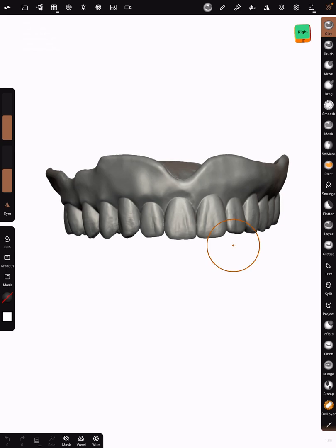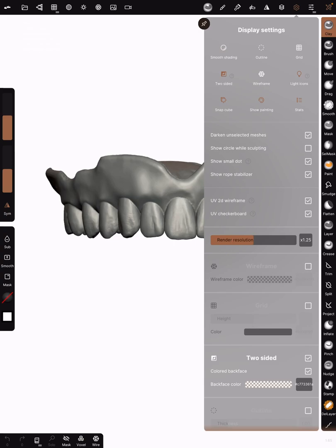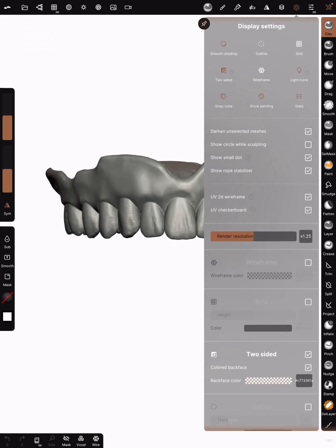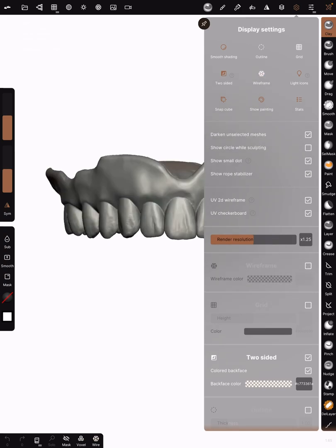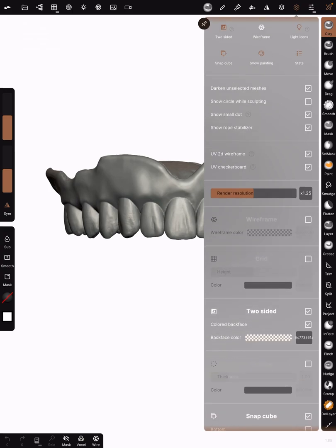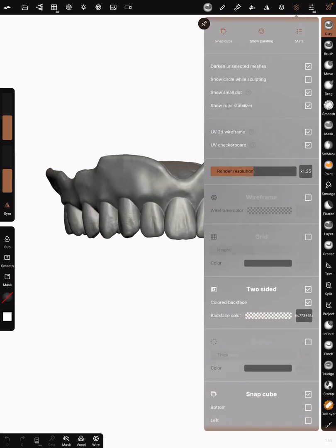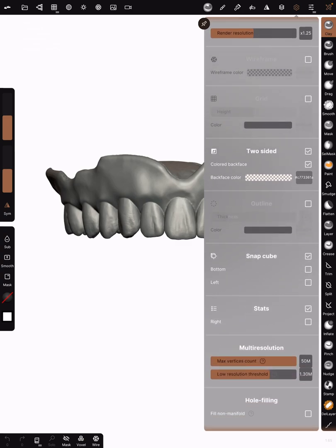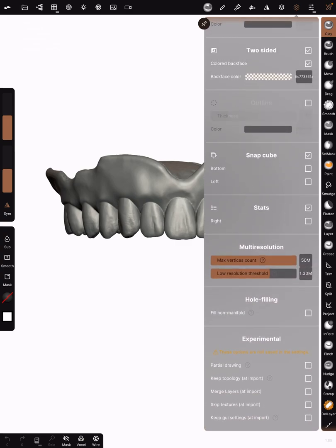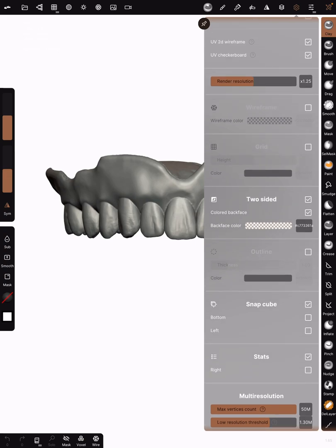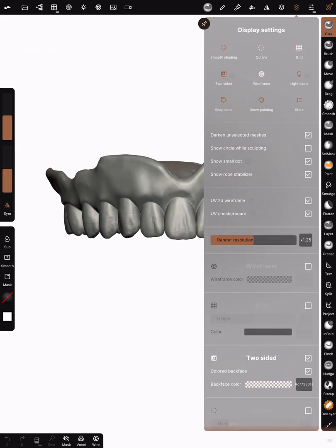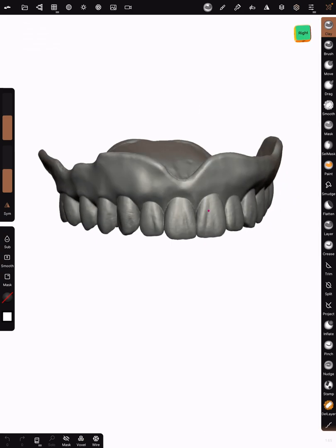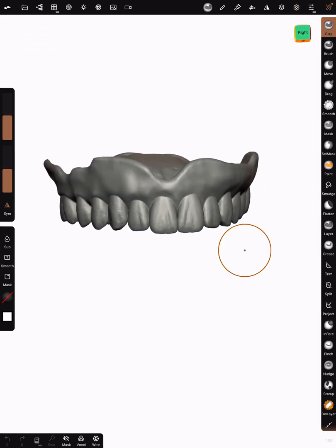If you go to your settings, you want to change to smooth shading. Make sure smooth shading is highlighted. You can turn wireframe on or off depending on which you want. Render resolution is default, everything else is pretty much default in the settings, but the main thing that I changed was that smooth shading.